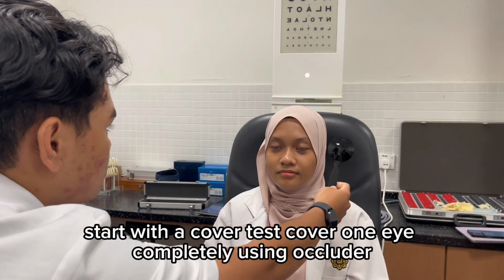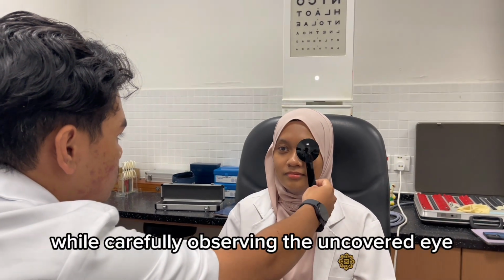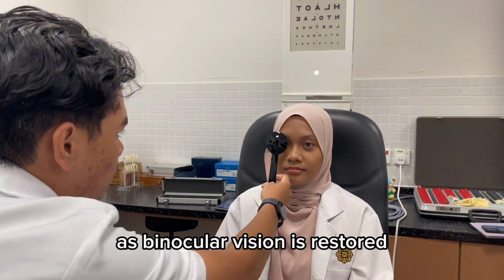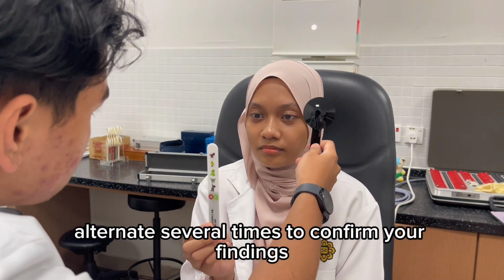Start with the cover test. Cover one eye completely using an occluder while carefully observing the uncovered eye for any movement as it takes up vision. Then, uncover the eye and observe for any corrective movement as binocular vision is restored. Perform the test at both distance and near fixation. Alternate several times to confirm your findings.